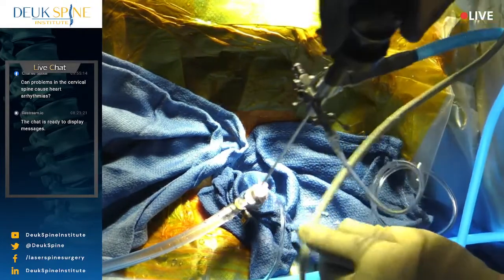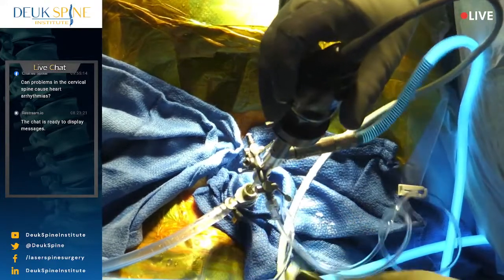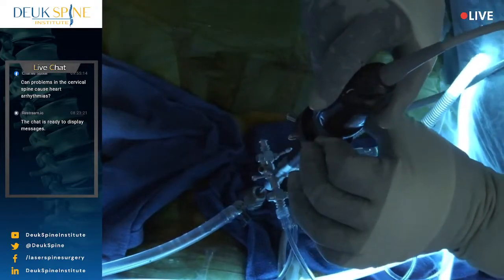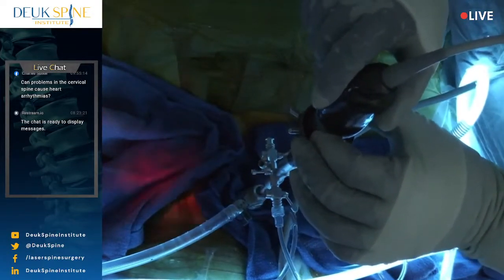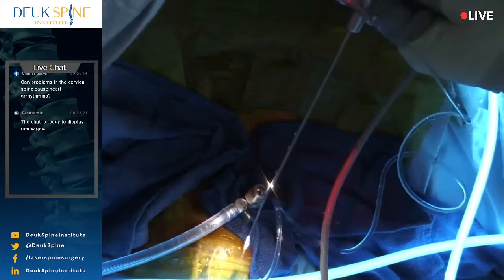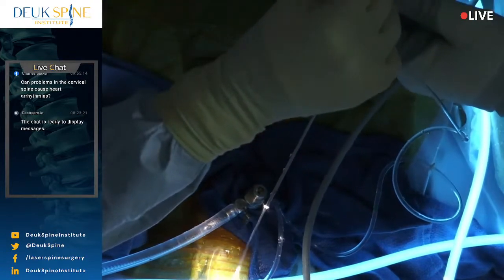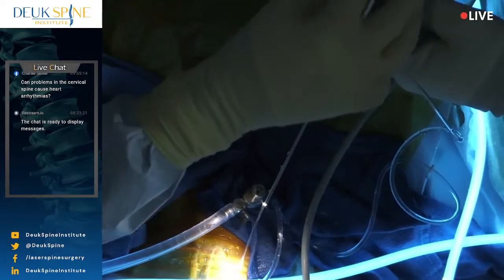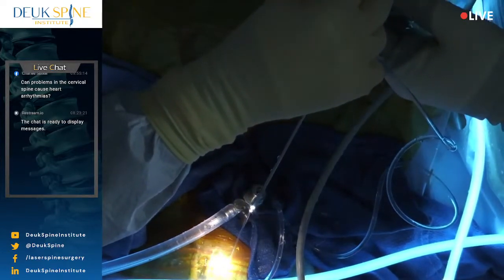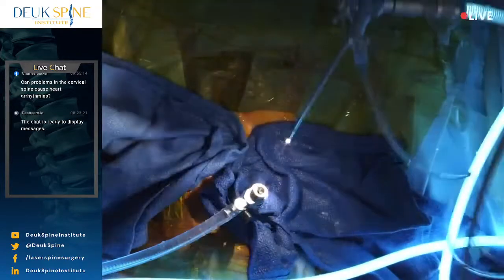This looks better. Yeah, it's the fiber optic bundle. So we're back to our good image. So it was the scope. Unfortunately, these scopes fail because the glue inside them that holds the lens or fiber optic bundle in place goes bad. And every time it goes bad, we have to send the scope in and spend $1,000 to get it repaired. Honestly, I think those repair shops are using the wrong glue so they can get more business. Okay?